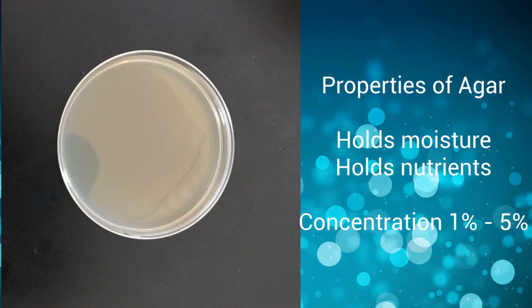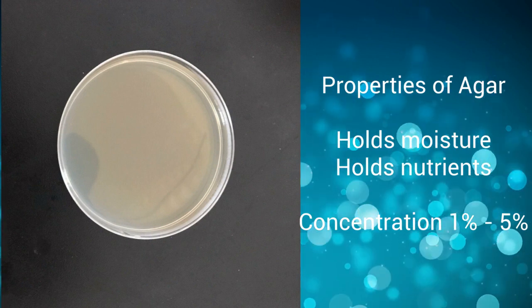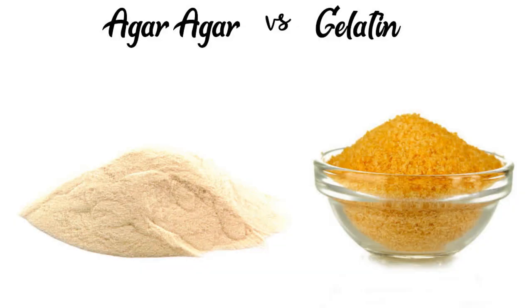Another property of agar is that it can hold moisture and nutrients and can be used in concentrations ranging from 1% to 5%. Another solidifying agent is gelatin that is used in concentrations of 10% to 15% to solidify the media.